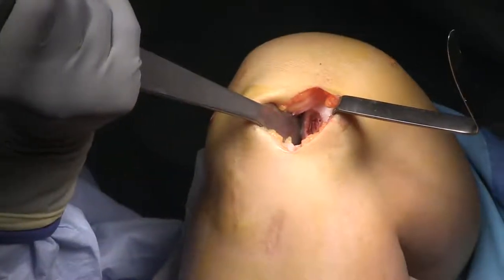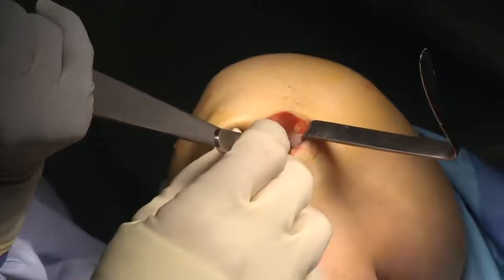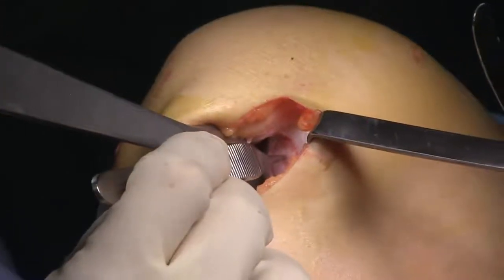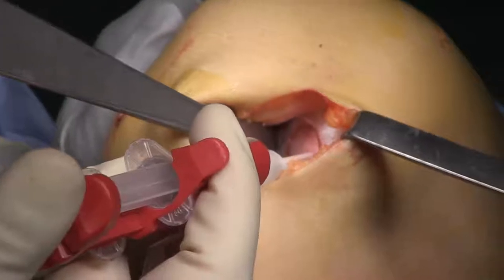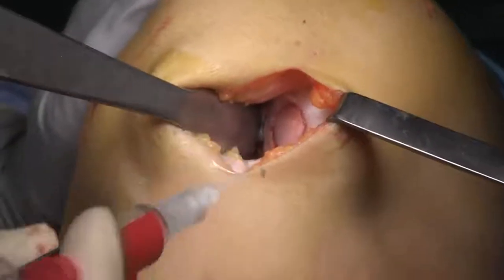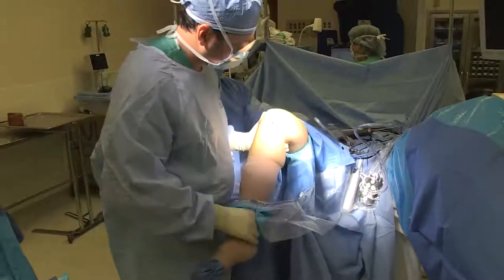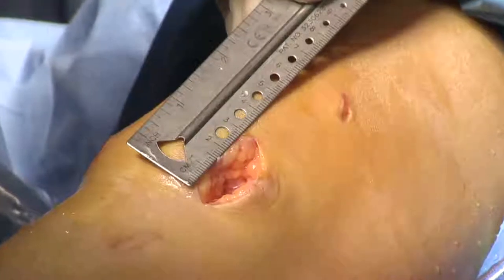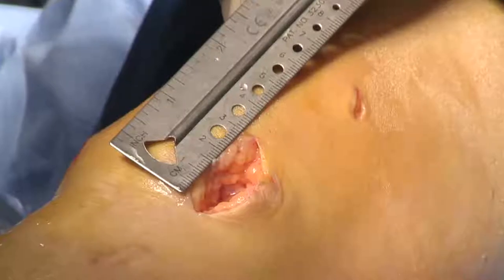Now we're ready to place the Prochondrix graft. I'm holding the Prochondrix graft carefully with a pair of forceps and placing it with the laser etching down, making sure we like the way it sits. If we don't like the way it sits, we can always trim it so that it sits flush at the base of the lesion. Now I'm taking the fibrin glue and placing it on top of the Prochondrix graft. I'm going to cycle the knee a few times after I allow the fibrin glue to cure and set, just to ensure the graft is sitting nicely and won't dislodge. You can see this incision is three centimeters long. You could probably do this arthroscopically, but the fibrin glue management becomes difficult, which is why my preference is to do it through a small arthrotomy like this one.